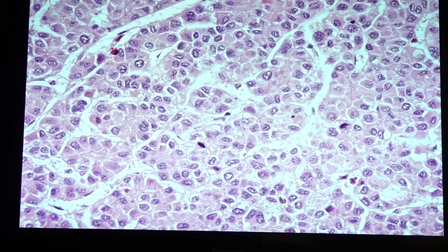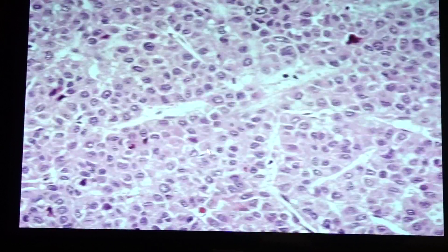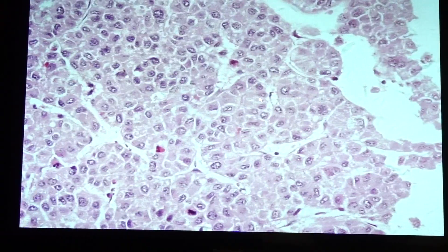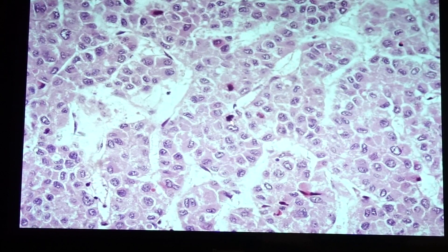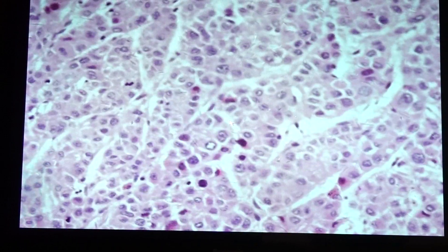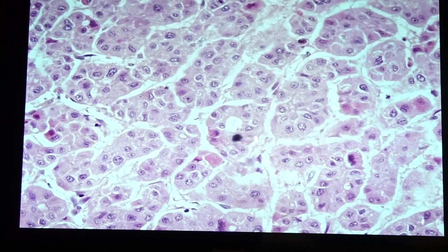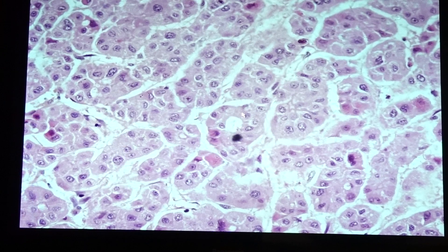Very prominent here is the presence of mitotic figures. Once you see mitotic figures and nuclear pleomorphism, you should think of hepatocellular carcinoma. There are multiple mitotic figures in this slide. Additionally, you can see the presence of rosette or tubular formation, which is not normally seen in the lobular architecture of the liver.